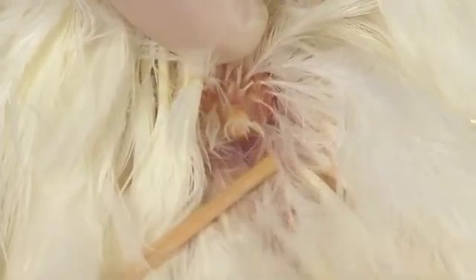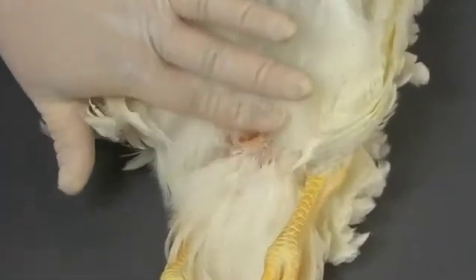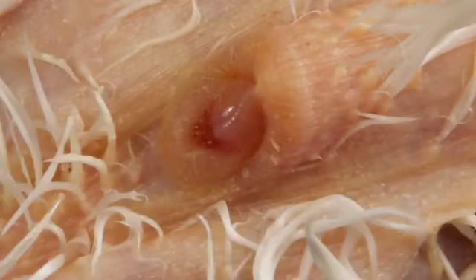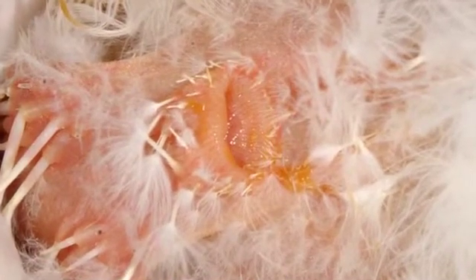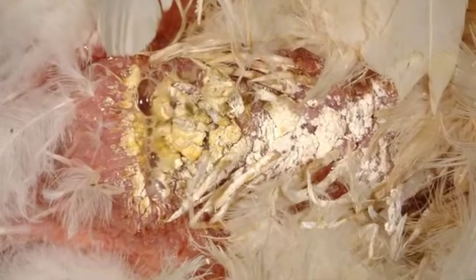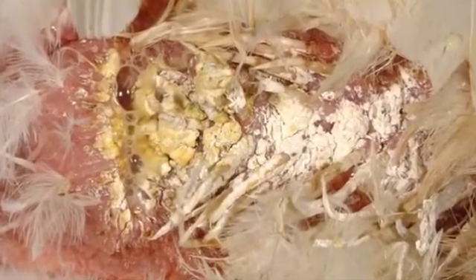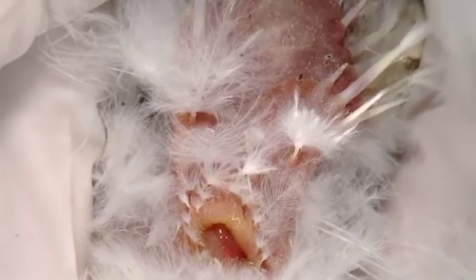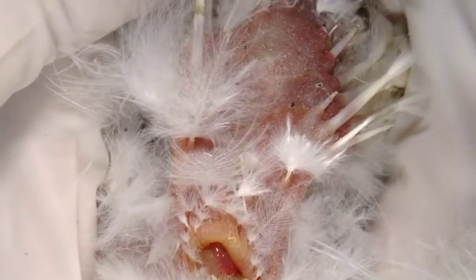Infected glands may result in swelling and reddening of the surrounding skin. Examine the vent located just beneath the tail. The vent is the external orifice of the urinary, genital, and gastrointestinal systems. Look for fecal staining of the feathers around the vent, indicating diarrhea. Crusting of urates suggests dehydration or husbandry problems. The vent can also become lacerated or abraded by interbird aggression.